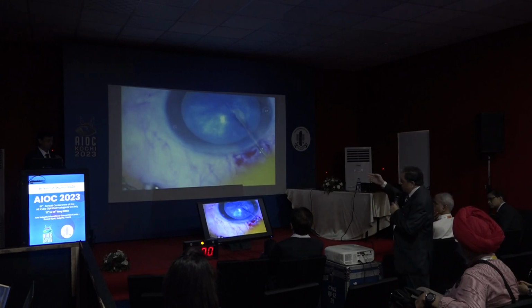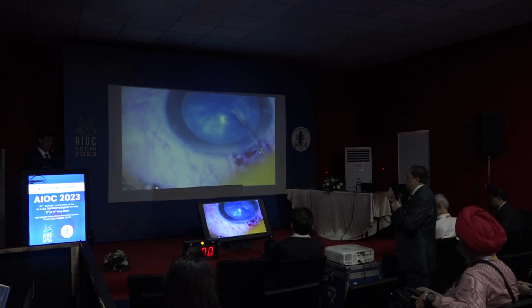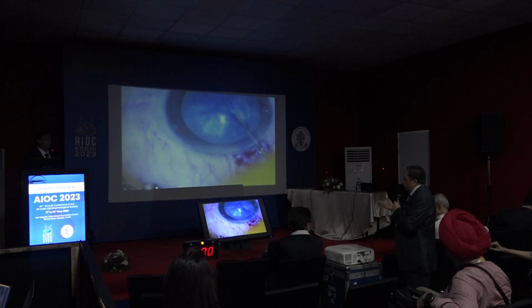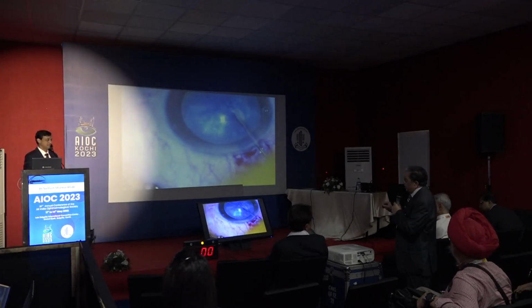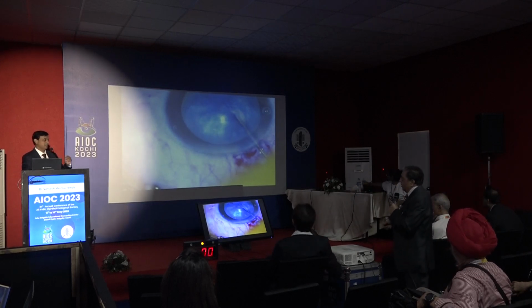Whether you can aspirate at the place where you showed a small tear when you went intralenticular to aspirate the cortex out. Even the introduction of your cannula itself can extend the tear and make it move to the periphery. I would have preferred not to go inside the capsular bag at all. Right over that point, if you have injected a very heavy viscoelastic material and suck it out, then I think it's fine. These are the two videos I just showed.